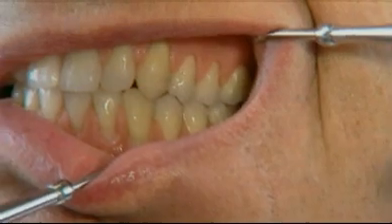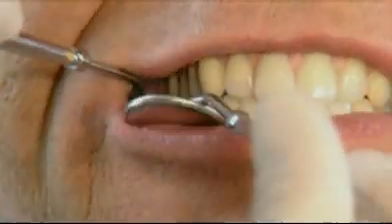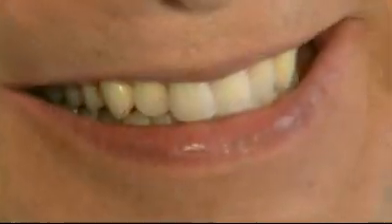Check the wax dentures according to the aesthetic cosmetic, static, functional, and occlusal principles. When trying in the wax dentures, the closing position must result in optimum intercuspation. No major adjustments should be carried out after the try-in. The dentures are returned to the dental laboratory for completion.